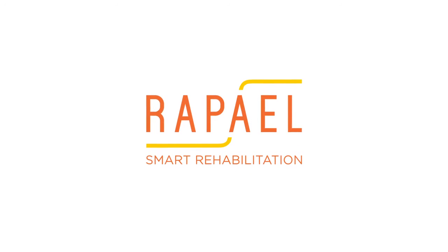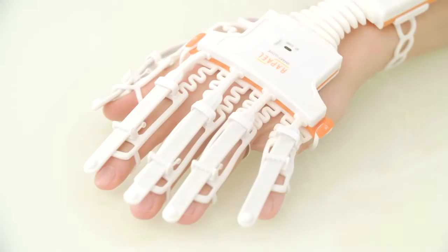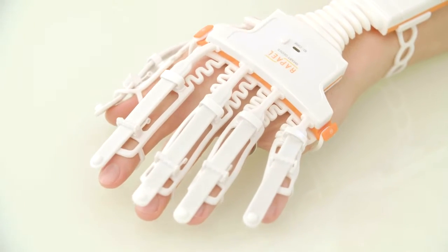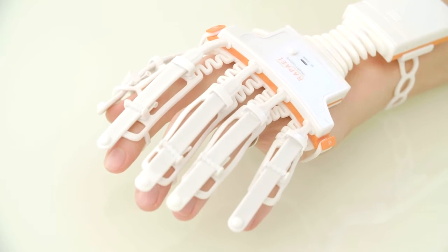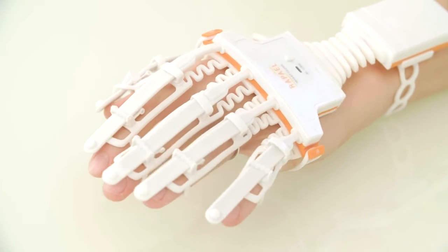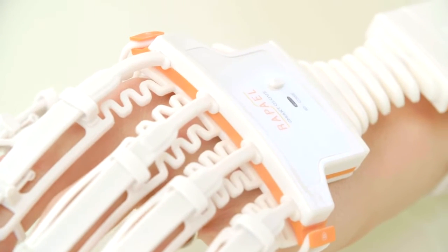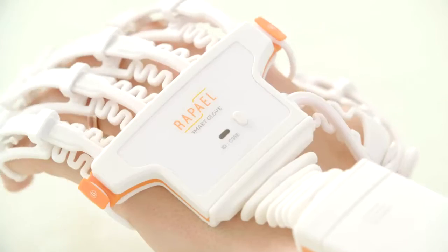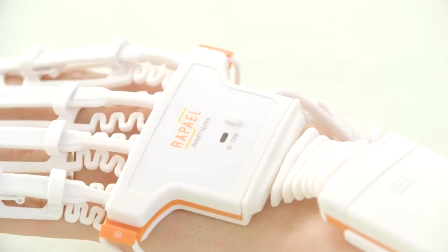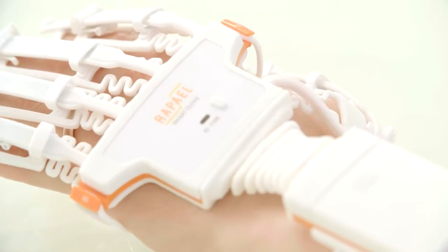Introducing Raphael Smart Rehabilitation. Try using Raphael Smart Gloves that will help patients with rehabilitation exercise more effectively. Raphael Smart Gloves recreate the spirit of Raphael, the kind-minded angel which healed the sick. It was designed with the human-centered principle to help stroke patients rehabilitate hand movement.